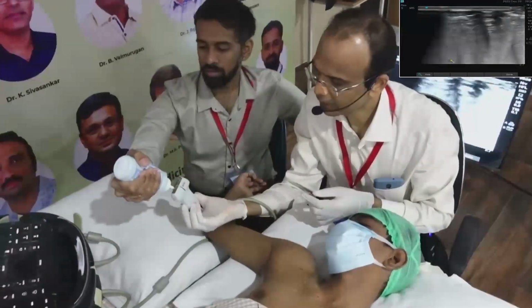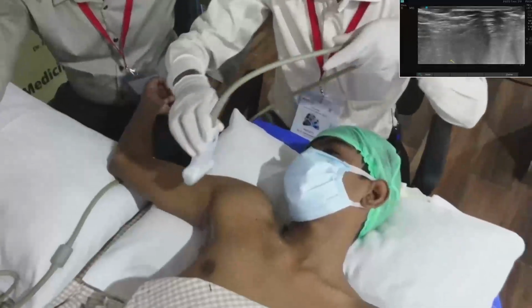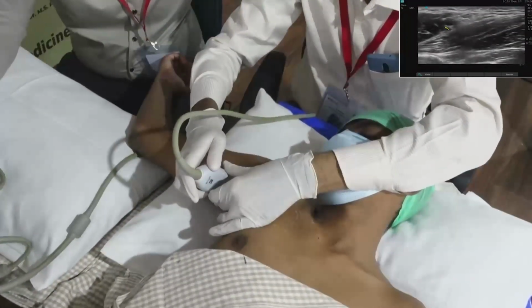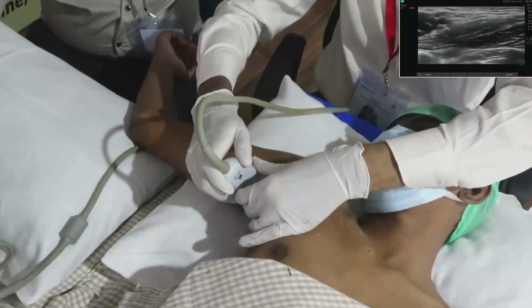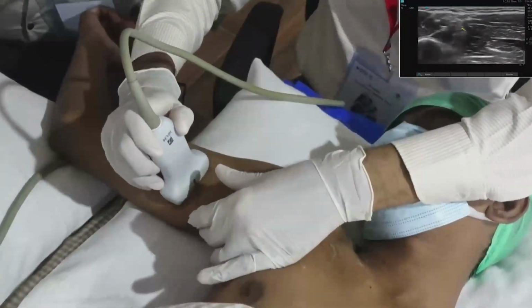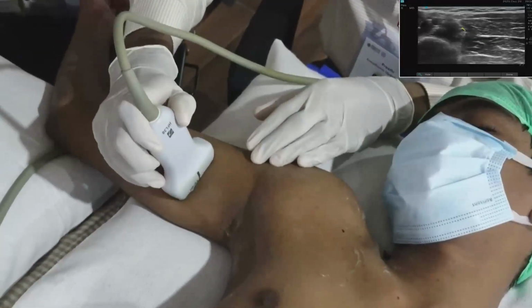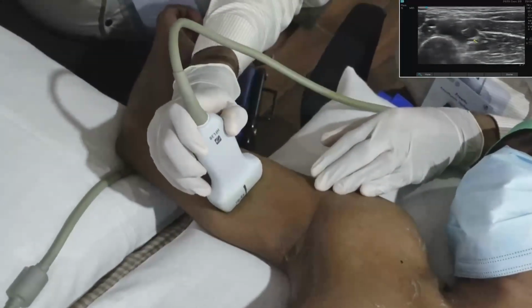So we had difficulty in seeing the ulnar nerve clearly, and we know how to trace it from the elbow. Now we had difficulty in tracing the radial nerve. Whenever we have difficulty in scanning the radial nerve, we have to go for a proximal to distal scan.